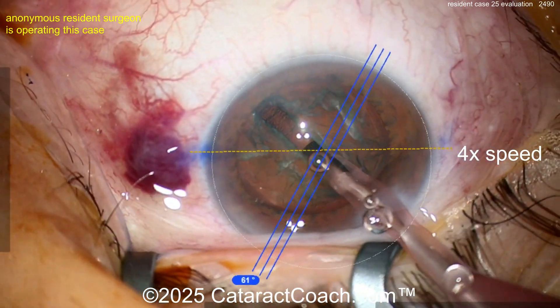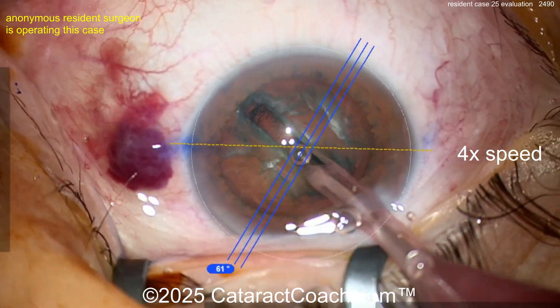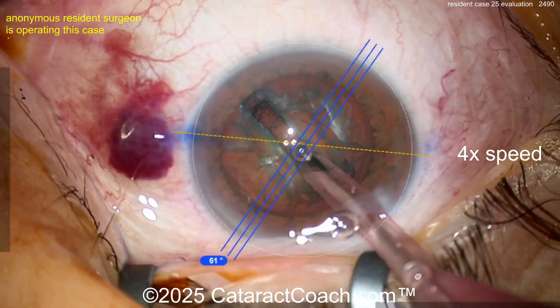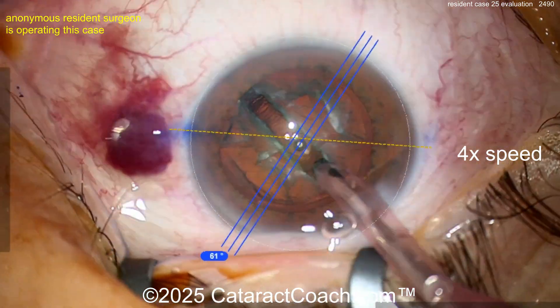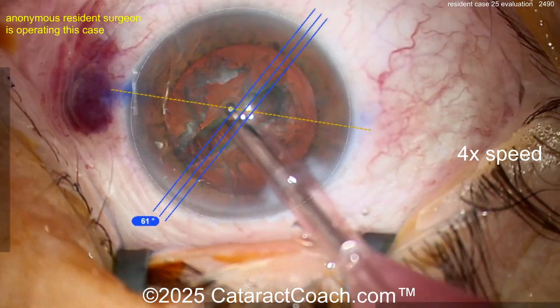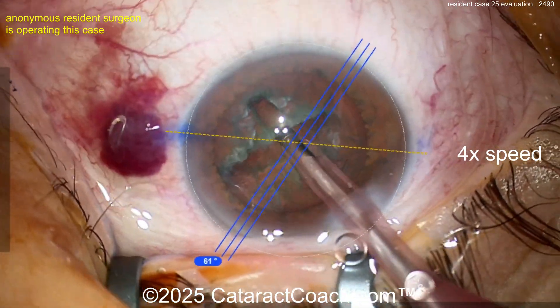Here's the groove down the middle. Try to get the eye in primary — see, the light reflexes are not quite in the center. You want the eye to stay in primary, you want to float within the incision with your instrument. Eye in primary — that's an issue right here. There's a rotation. Where's your second hand? What are you doing with the left hand?